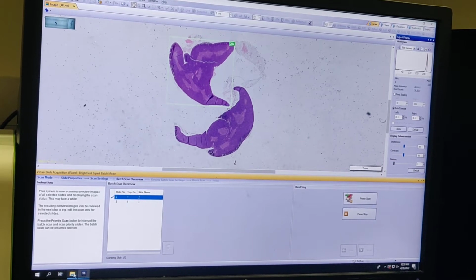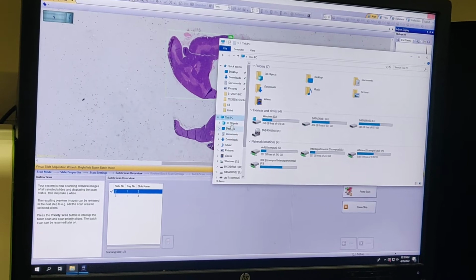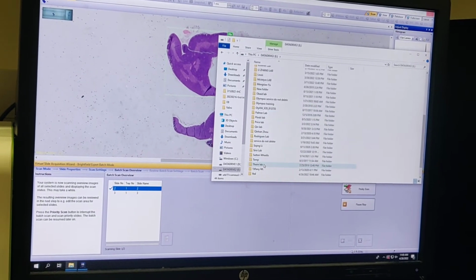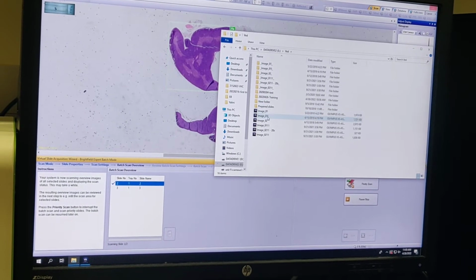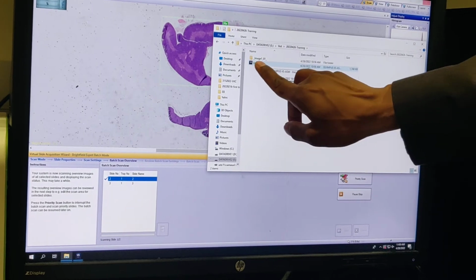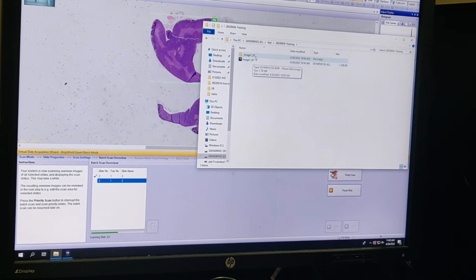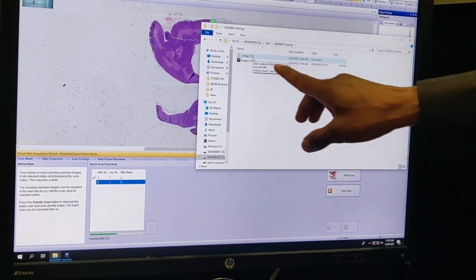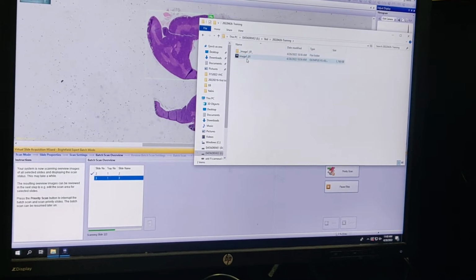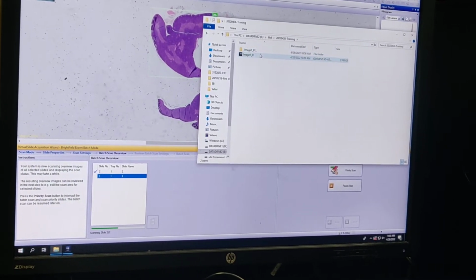Okay. While the scan is going on, let me show you the folder design so that you can know how to access the files. So if I go to here, and today's training is going on, the file will be a tiny file like 1.7 megabyte, but the corresponding data will be stored in this folder, which is like 200 or 300 megabyte. Okay. So if you compare the names, both names are same, just the underscore is in forward and backward.